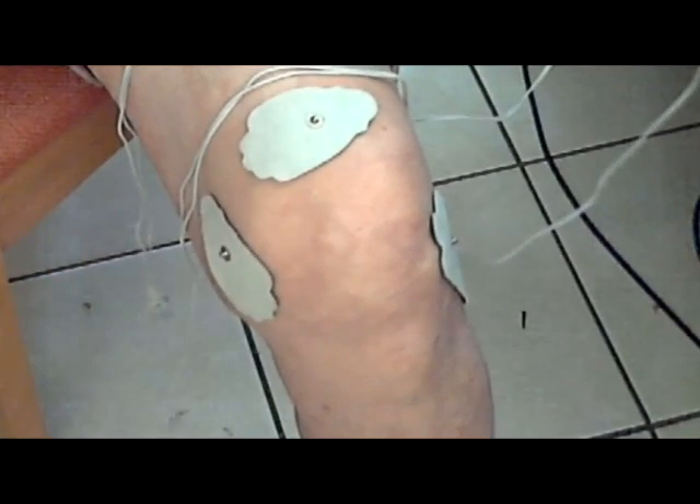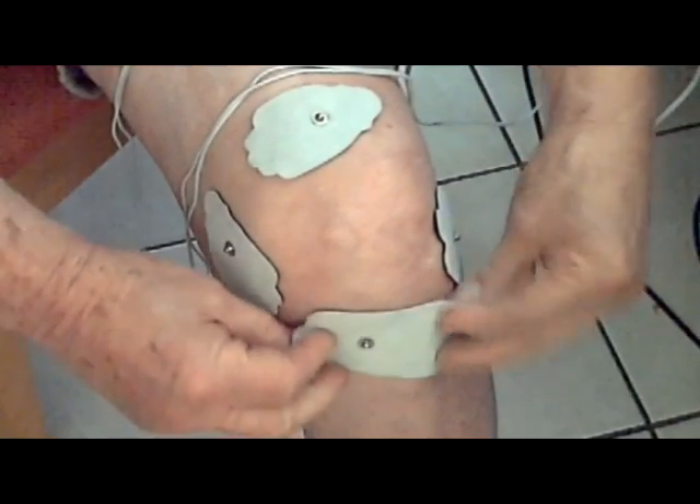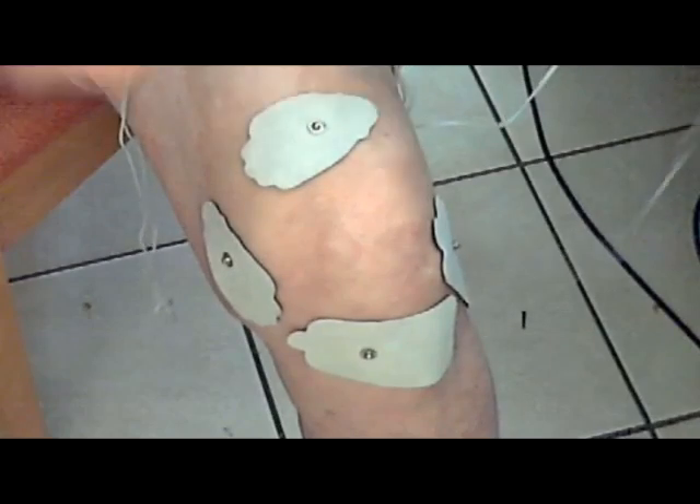You'll notice that this one is a bit lower than the first one. One of your TENS leads will connect to these two. Then place an electrode immediately beneath the kneecap and another immediately above it — your other lead will connect to these.